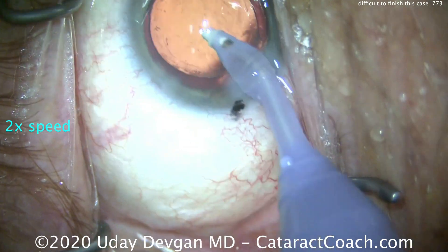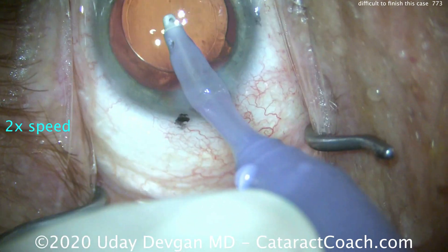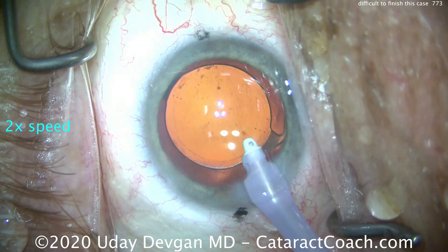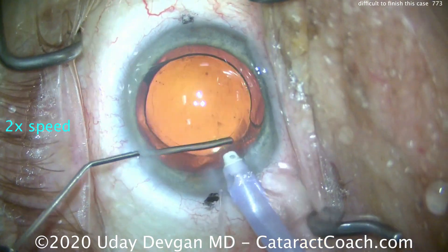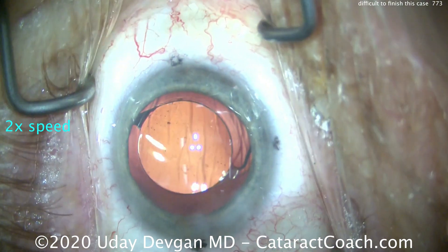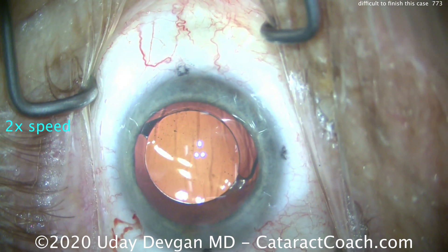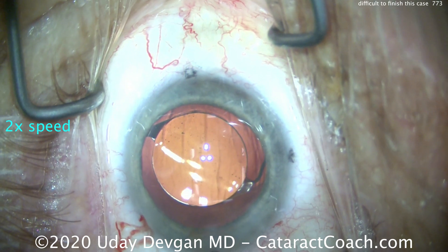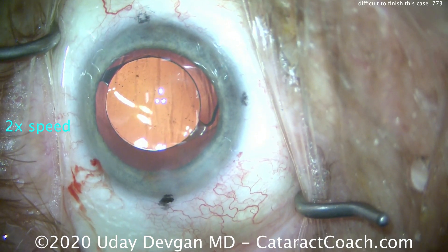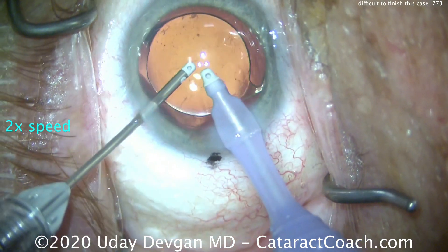So what are the other options? Well, you could do a pars plana stab and try to get out some of the fluid that's accumulated in the anterior hyaloid face — that's one option. You can also do what I did here, which is just increase the infusion pressure and hope that most of that infusion pressure is going to deepen the anterior chamber instead of going behind and causing more fluid to accumulate in the anterior hyaloid face. So again, we're still having a challenge. Look how shallow the anterior chamber is. Now the fluid that's left in the anterior hyaloid face will equilibrate, absorb, and be gone within a day or so — no issue leaving it there. But I don't want to leave the case like this or leave the patient with the IOL not in the appropriate position. So now we're going to do a bimanual approach to get that last bit of cortex out — don't leave it behind in the eye.